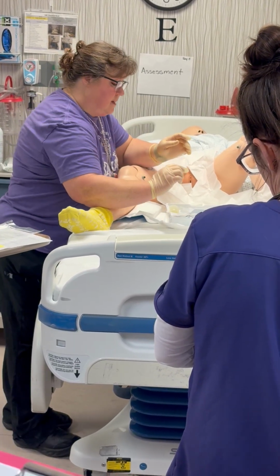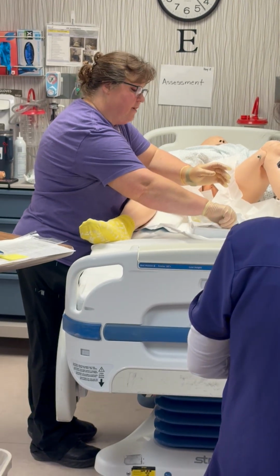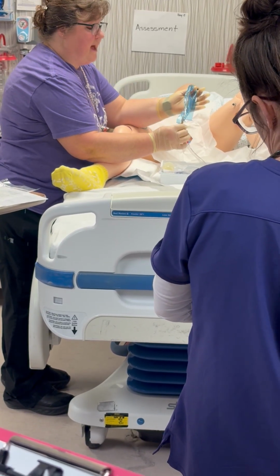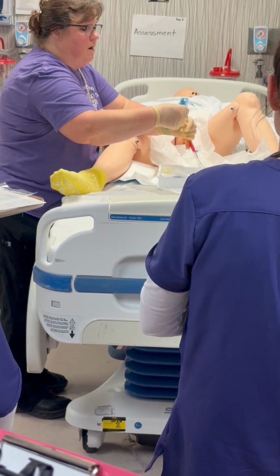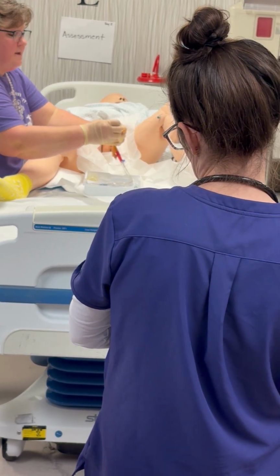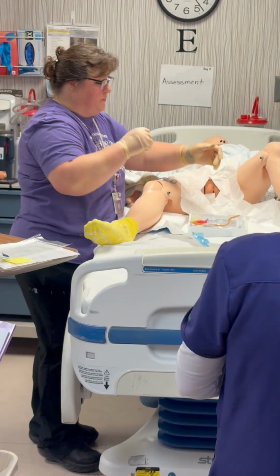Next thing is my opening up of my catheter. It's usually got the blue on it. You need to make sure that this just doesn't flop outside your sterile field. So when you do this, you are taking this off. I usually try to keep it kind of rolled up in my hand, because this is all sterile, right? And then get rid of this blue. Drop this back down in here, taking this out and around and dropping it.